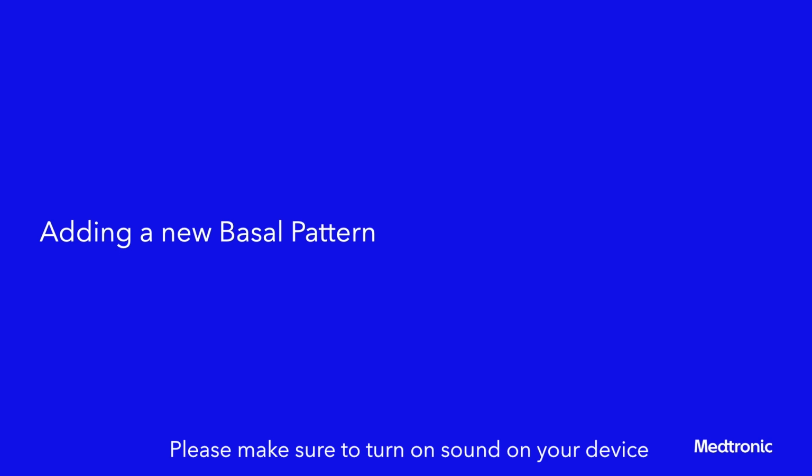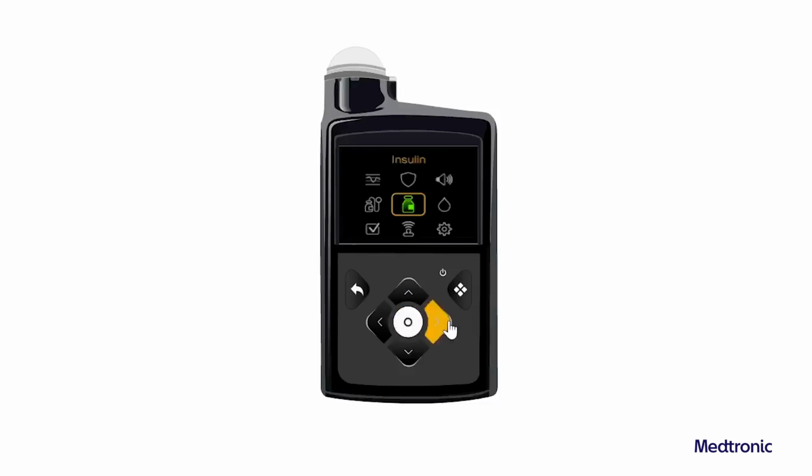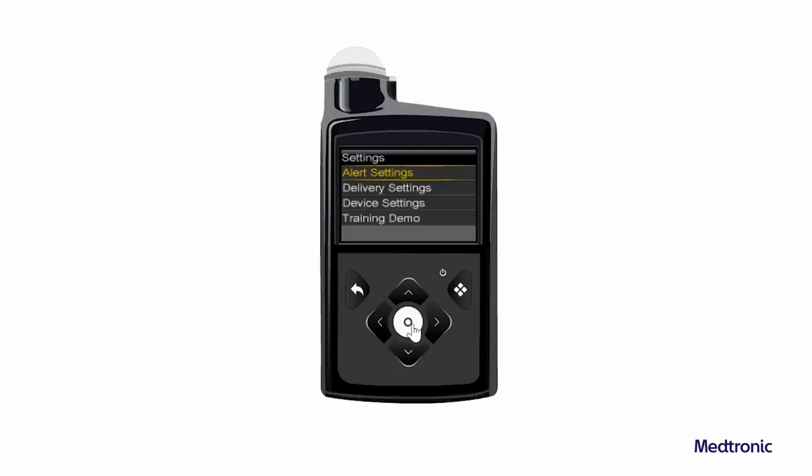We will now show you how to add a new basal pattern for the first time. To add a new basal pattern, from the home screen, press Select and then select Settings. Select Delivery Settings and then Basal Pattern Setup. Select Basal 1.